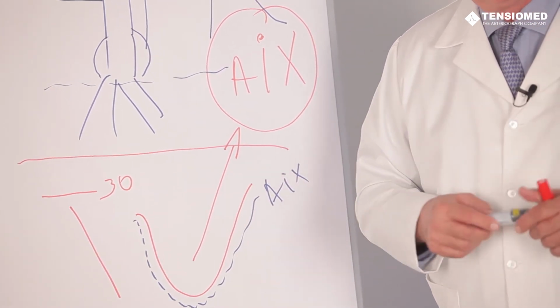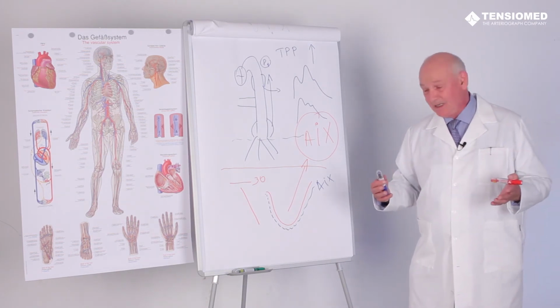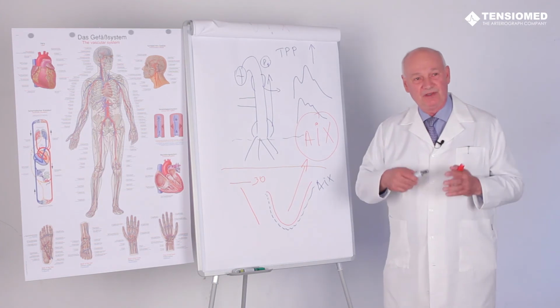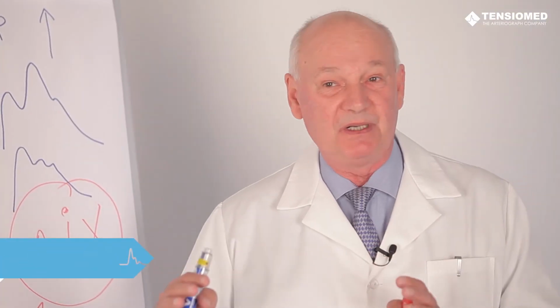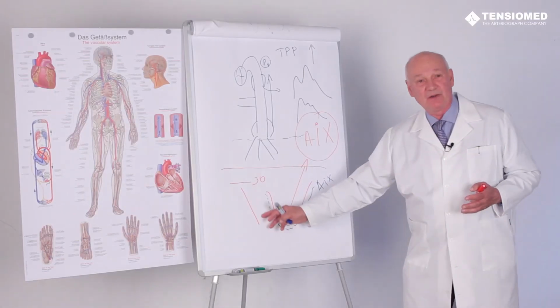So in case of endothelial dysfunction, when increased peripheral vascular resistance exists, this measurement provides information about the very early stage of atherosclerosis, when only the small arteries are affected, and when only the small arteries are more constricted due to the missing nitric oxide synthesis.